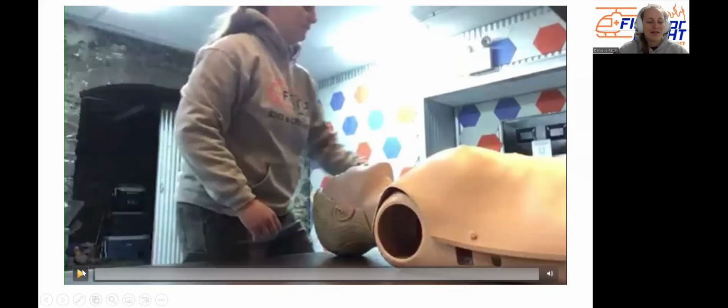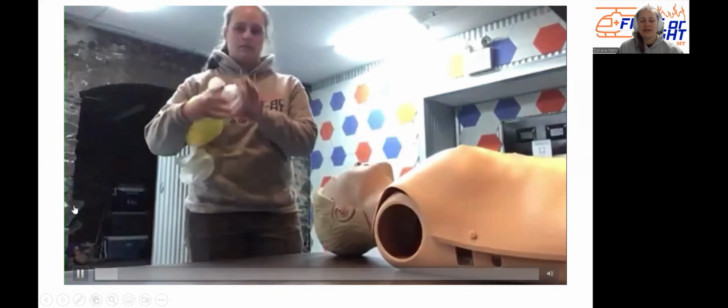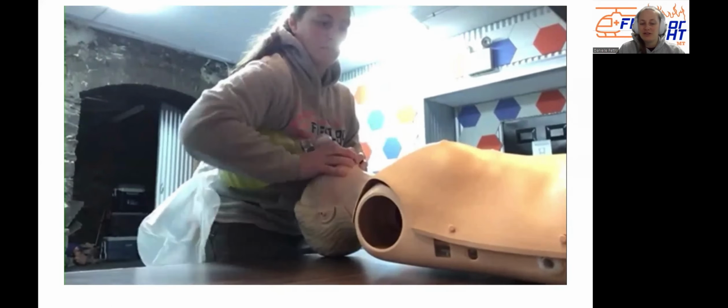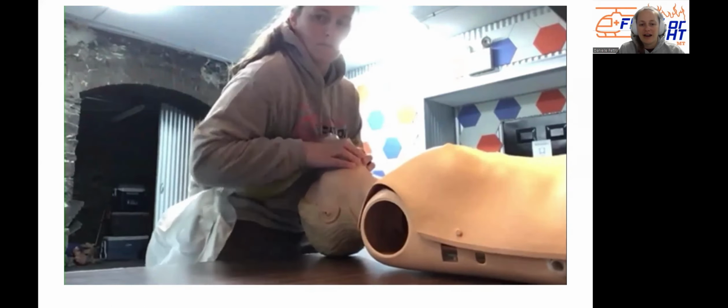This is a video of me demonstrating what they call the chicken wing method. Ignore my really intense look into the camera. I was trying to make sure that I was in the frame. But you can hold the mask with 2 hands and then basically use a chicken wing. Bring your elbow down on the bag. I'm obviously not going 5 seconds between breaths here. I'm just demonstrating how this looks.